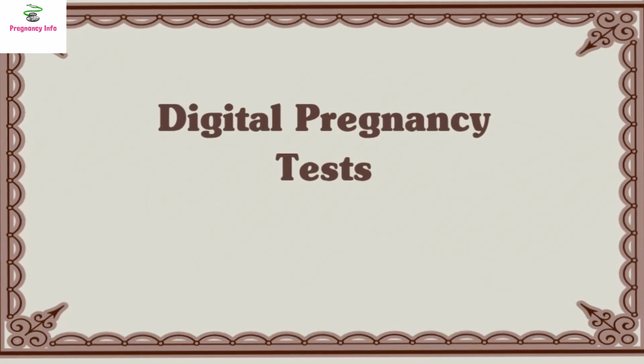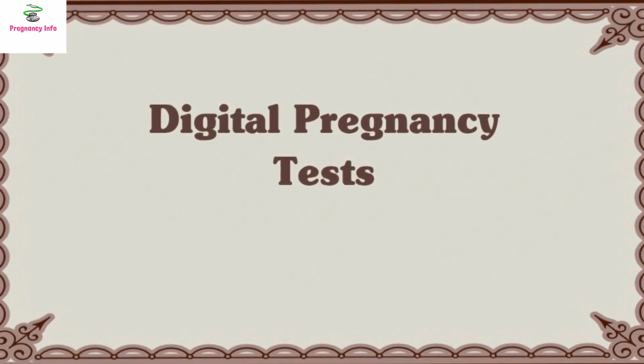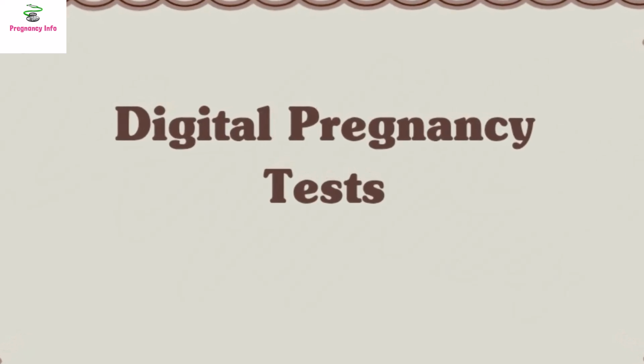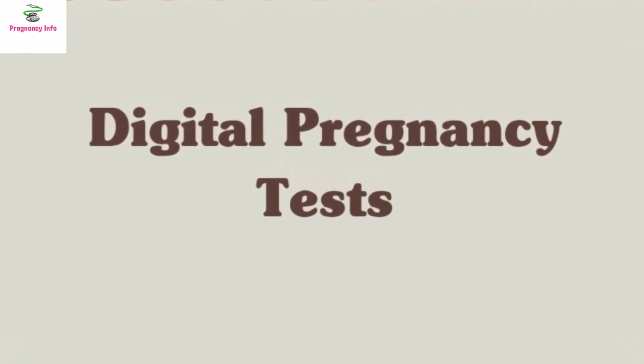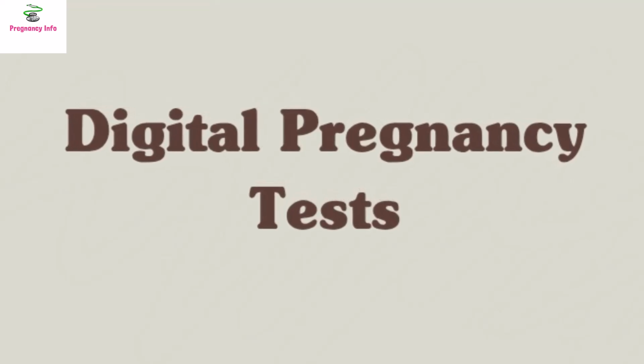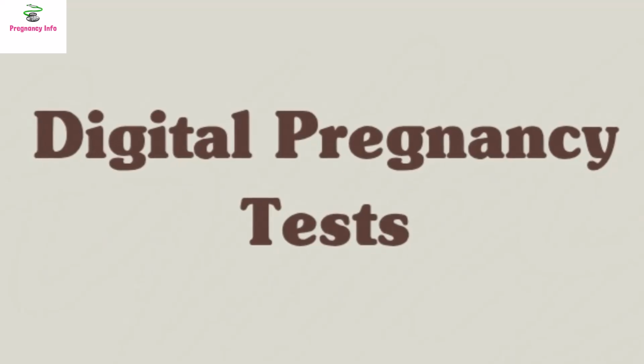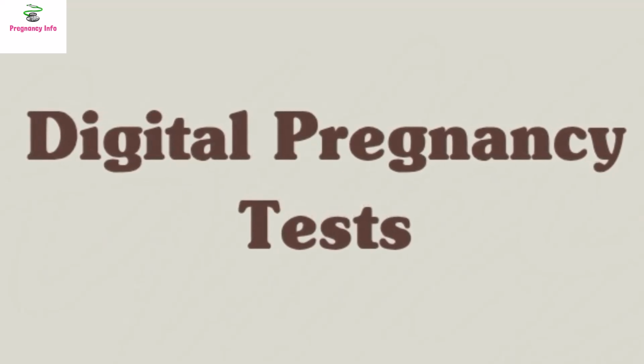Number 3. Digital pregnancy test. Examples: Clearblue Digital, First Response Digital. Digital tests work similarly to midstream tests but provide results in text form such as pregnant or not pregnant. Some even estimate how many weeks you have been pregnant based on hormone levels.